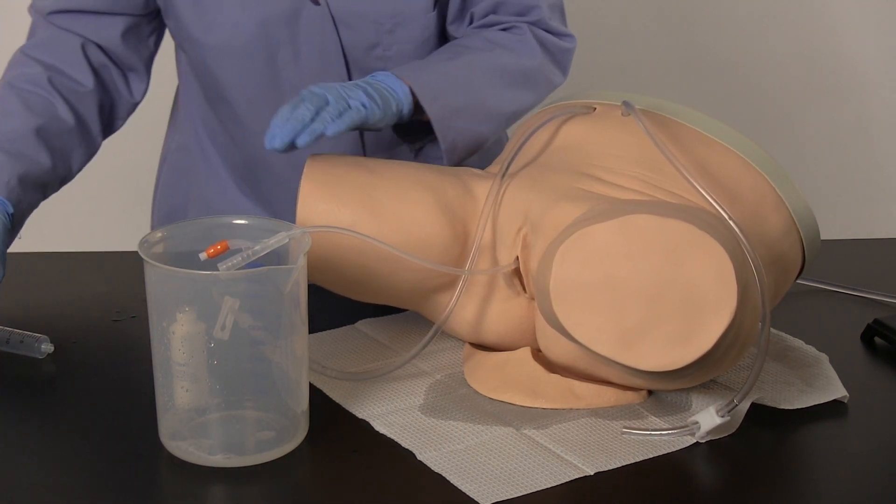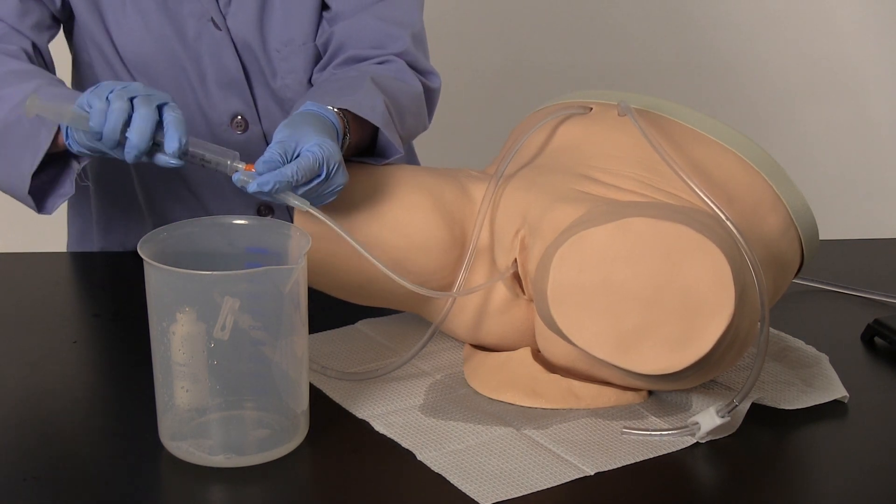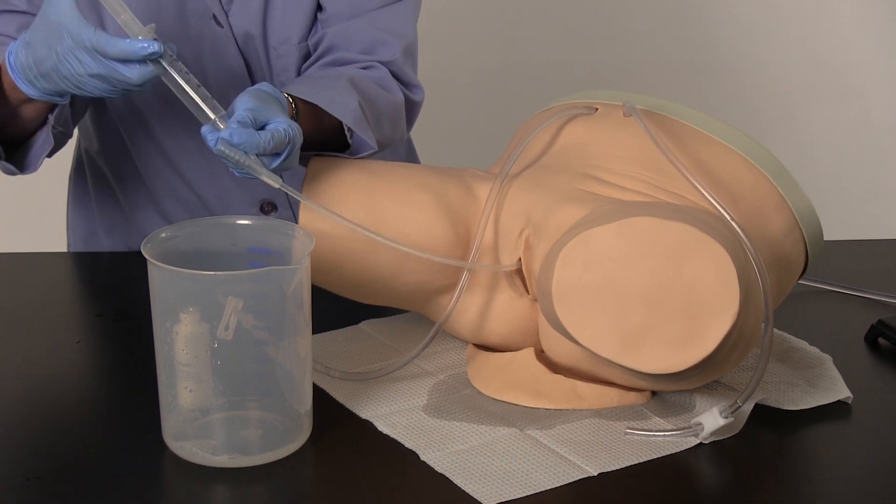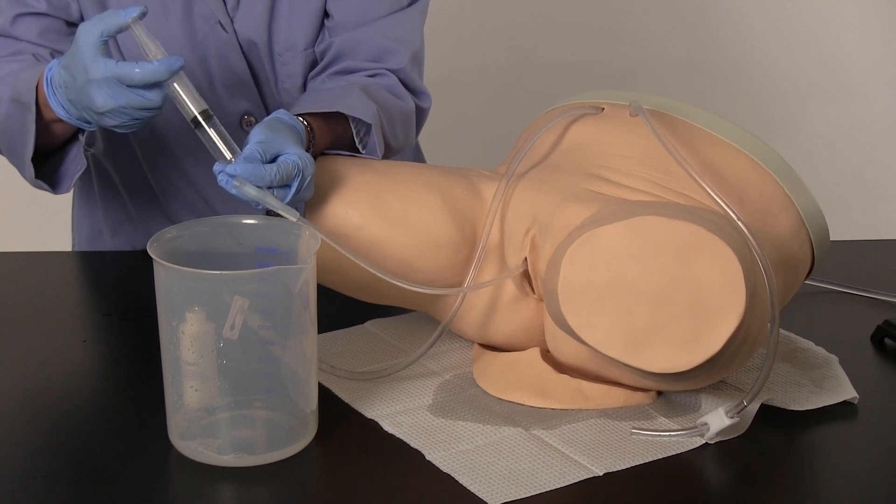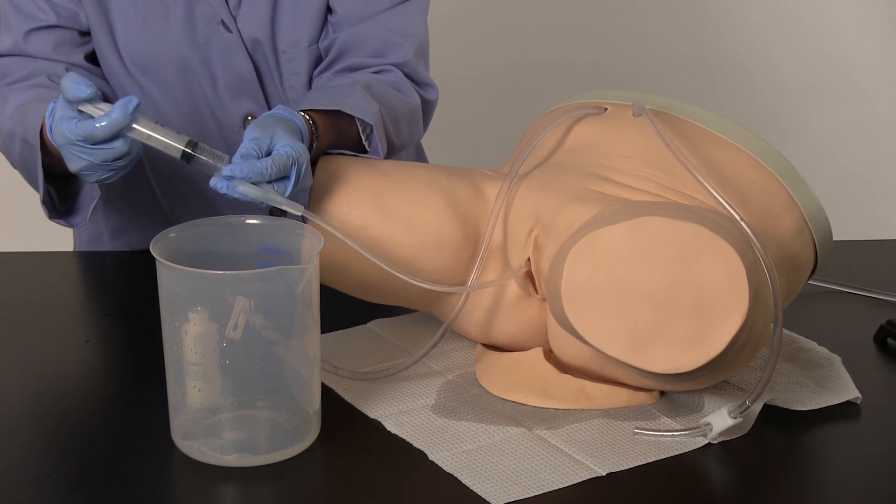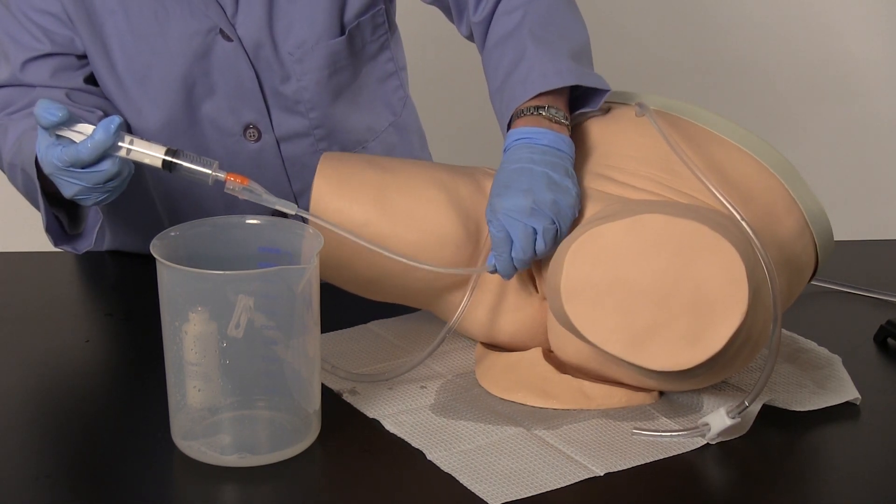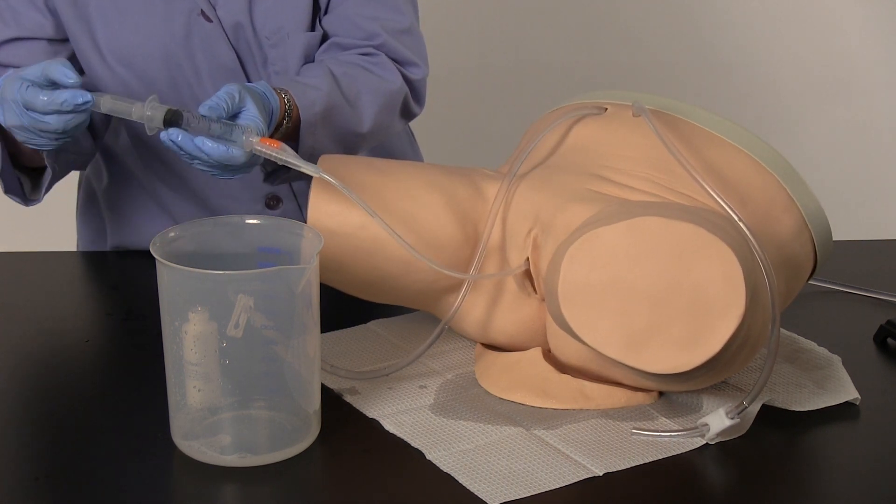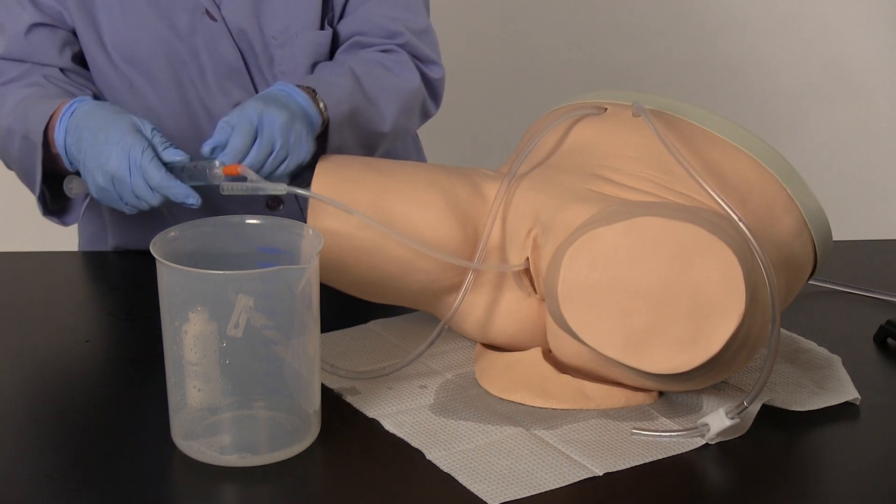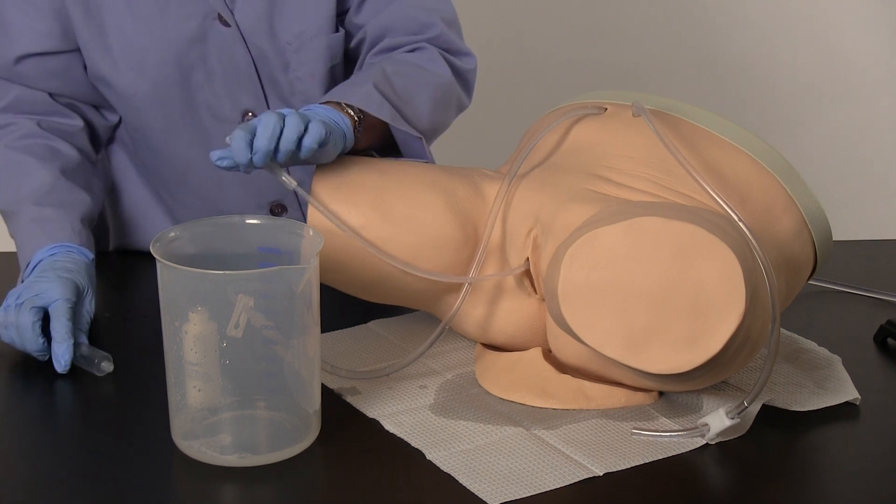Connect the 20cc syringe to the threaded end of the catheter, ensuring the syringe is pulled back and filled with air. Depress approximately 10cc of air into the catheter to fill the cuff. Gently tug on the catheter to determine proper inflation. Pull back on the syringe, completely deflating the cuff before removing the catheter.